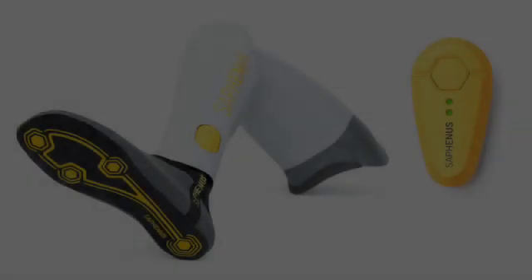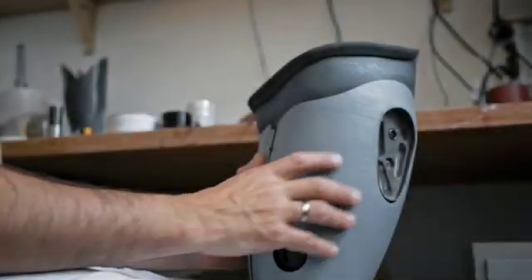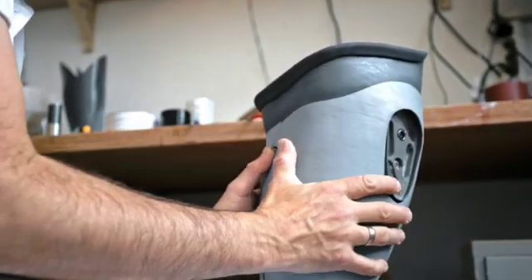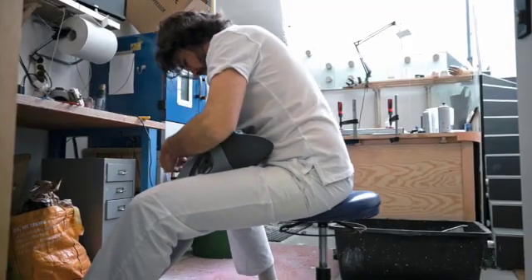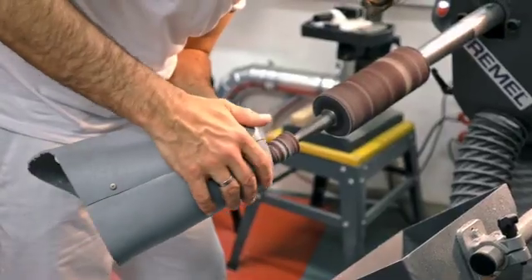The new sensory feedback system Suralis allows, for the first time, an amputee to get feeling from the ground on his lost foot via the prosthesis. He's feeling the ground, and this sense of touch helps to reduce phantom pain problems and to enlarge the stability in walking.